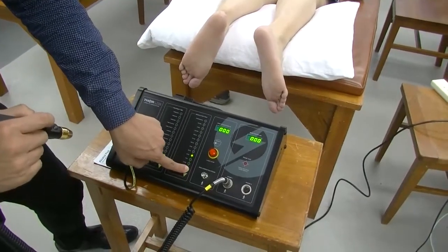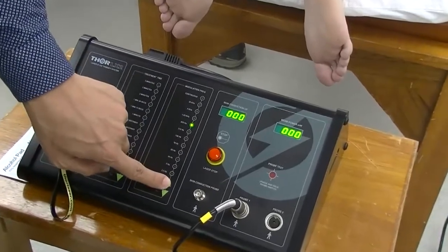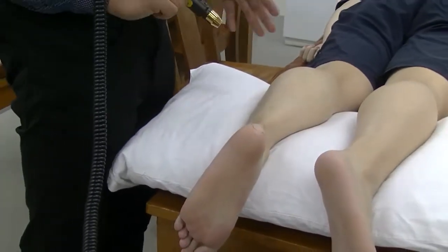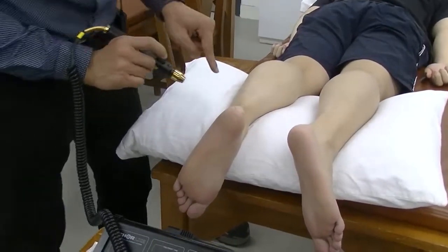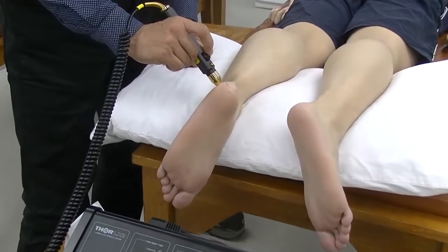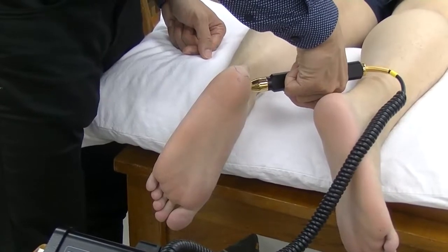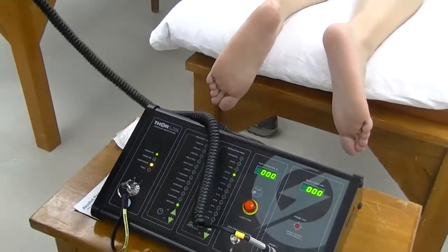For facilitating wound healing, both for the wound area and the surrounding peripheral sites, we set the frequency to around 1.25 kilohertz. We inform the patient that the probe will touch the skin. Once the button is pressed, we count — one, two — then move to the next spot: one, two — and the timer stops automatically. The last spot is counted the same way: one, two, stop. The surrounding area treatment is now complete.